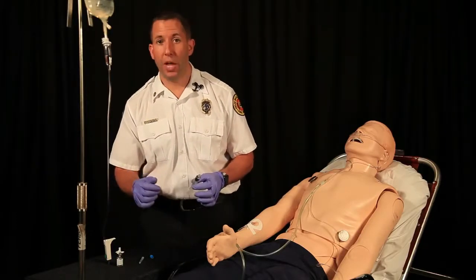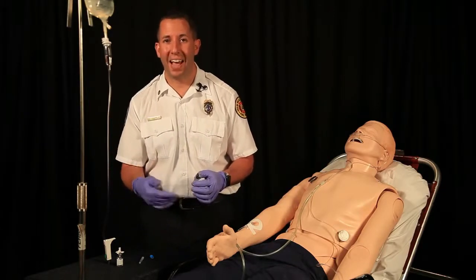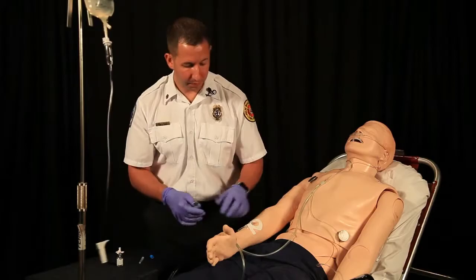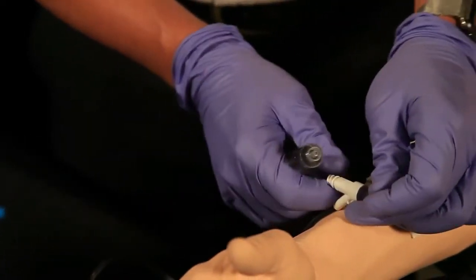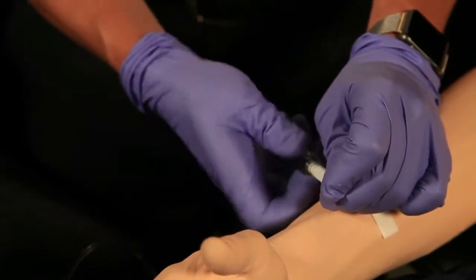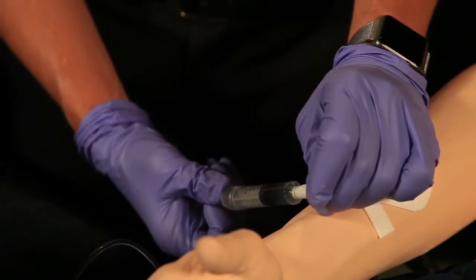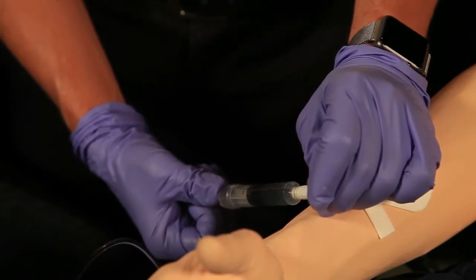So what we have to do now is, just like every other ketamine administration, we have to dilute the dead space with normal saline. So we'll make sure we have our running patent IV or IO line. We're going to go ahead and clamp it off from our particular patient who's getting the ketamine. And we're going to go ahead and draw in the normal saline to our 8 mLs of dead space in our syringe. And you'll see it's going to easily fill up the chamber of the syringe with the normal saline.